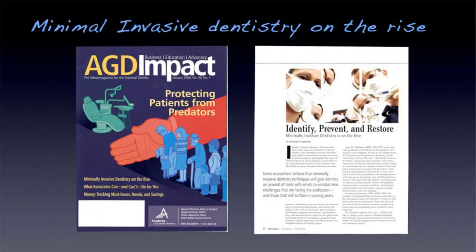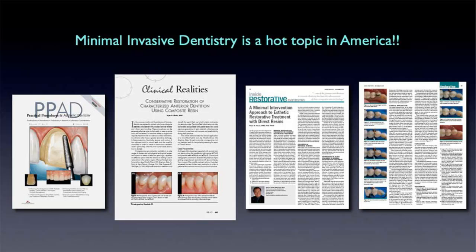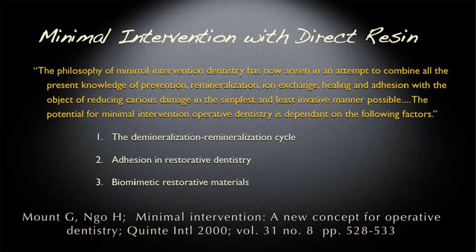Minimal invasive dentistry is also about prep design and making sure that we have good preparation burrs and methods of being able to reduce and hold on to as much tooth structure as possible. I love these burrs here.